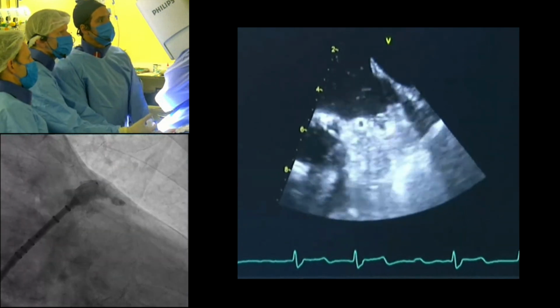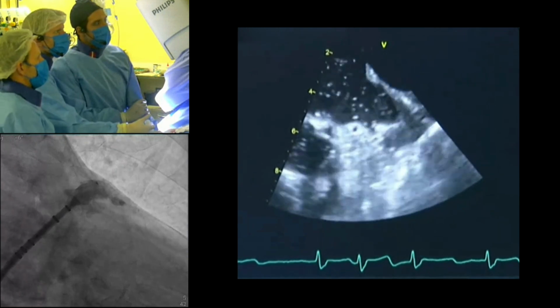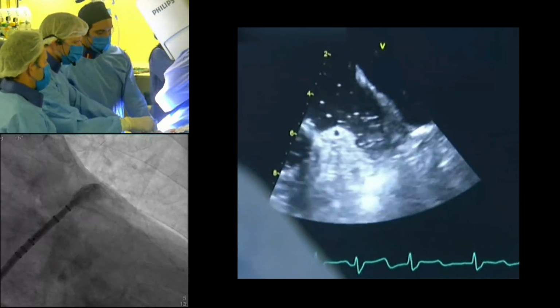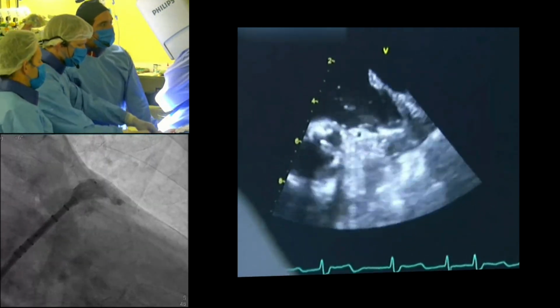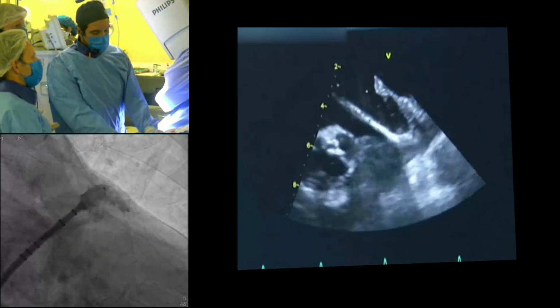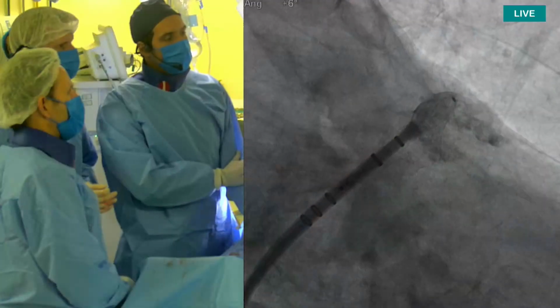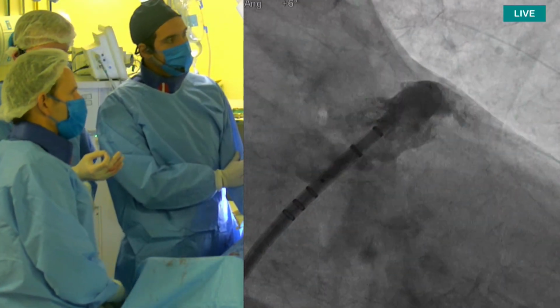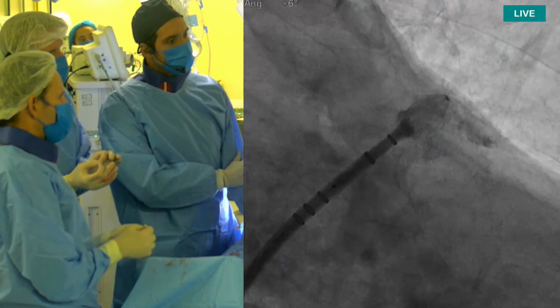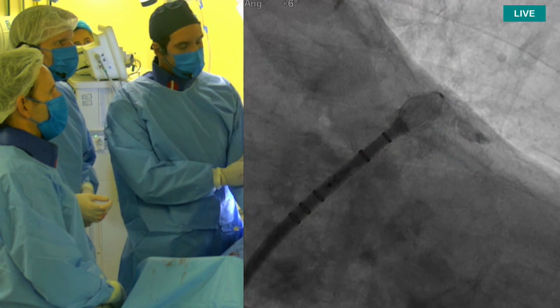Yeah, so we are a little bit in that small lobe. You see that? Yep. So we have to get out of there, but I think it will almost automatically come out. Yeah, that's what I thought. I would continue combining the push and pull, but not too much push on the device. A little bit of push on the device, and mostly pull back on the delivery, and then I think it maybe comes to sit really nice in a good position.